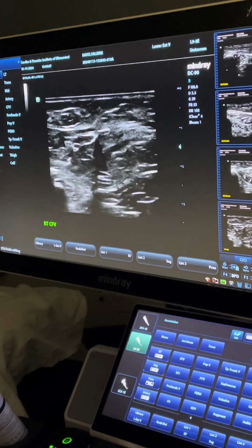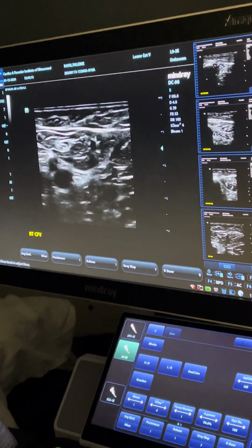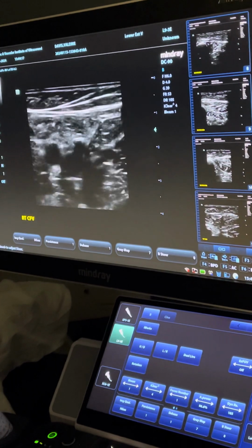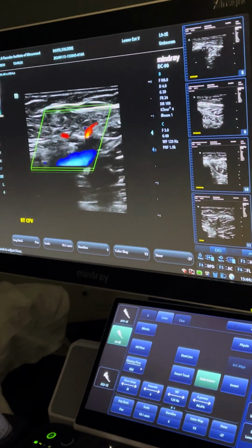Is done. I'm coming up to my common femoral vein. You see me put a towel kind of at the distal portion of her leg, so whenever I go to distally squeeze, I don't put my hand straight in gel. So come up to your common, turn long. I want you to angle up towards the groin.